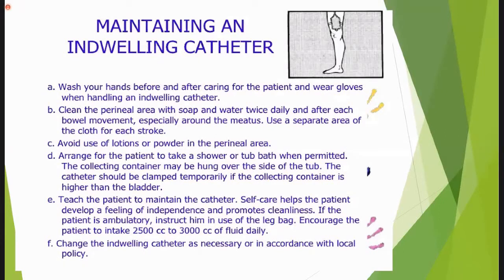the tube into the bladder until urine flows, and then urine will come, and you have to fill the balloon with sterile water. Inflate the balloon with sterile water and pull back the balloon for checking the patency.